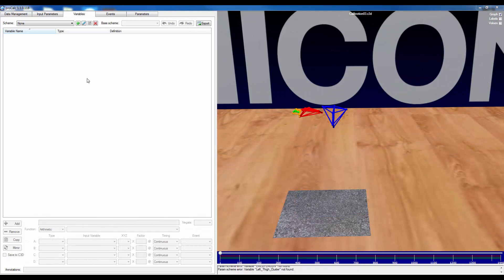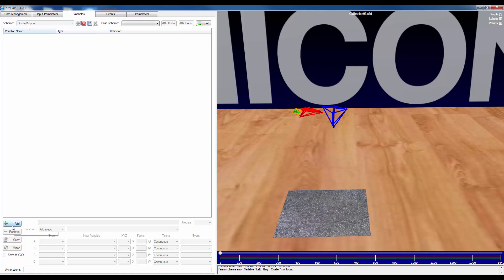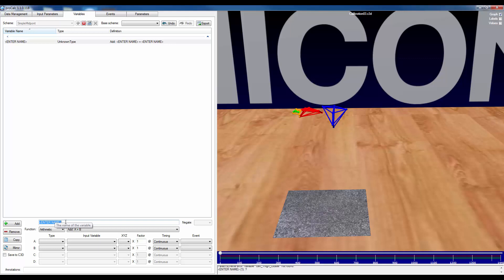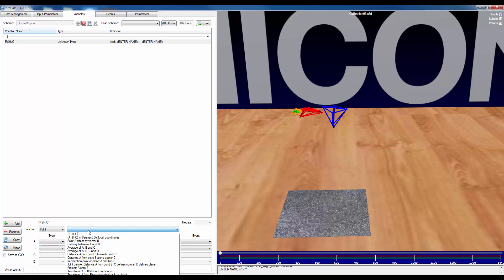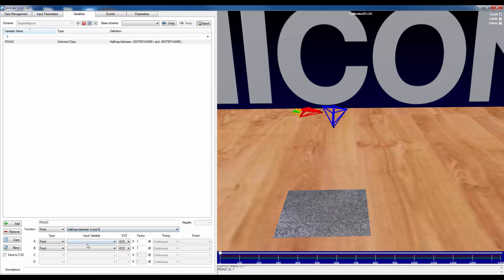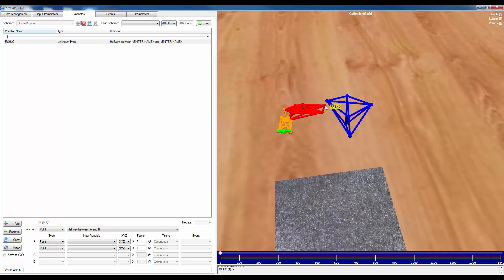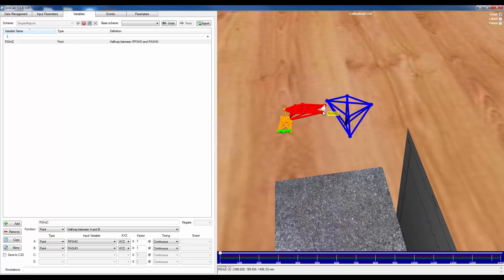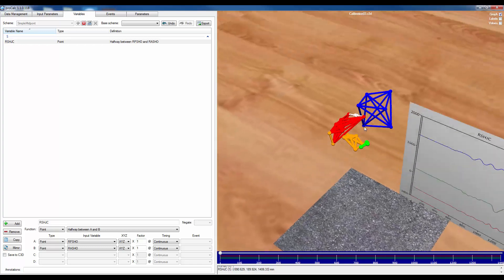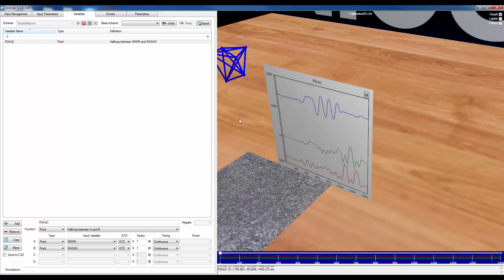To calculate a simple midpoint, I have navigated back to the variables tab. ProCalc uses schemes in order to save the calculations that are being performed on a trial. To create a new scheme, I'm going to click on the scheme plus button and call this 'simple midpoint'. I'm going to add a new calculation, name it 'right shoulder joint center', select the point function, and choose halfway between A and B. Then I select the posterior and anterior shoulder markers in the workspace, and you can instantly see a preview of where that simple midpoint is going to be, with XYZ components shown as well.